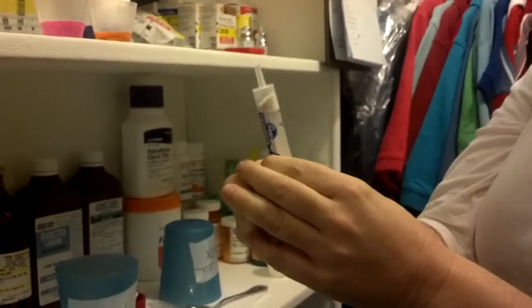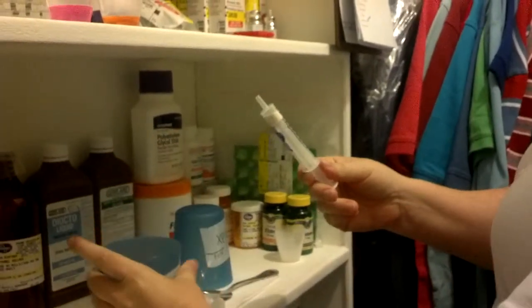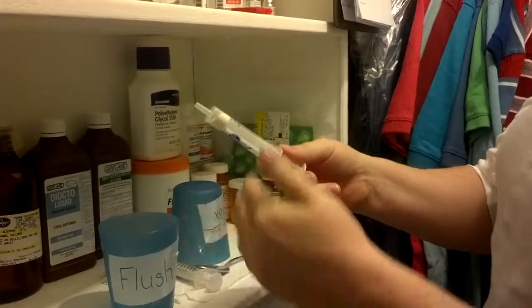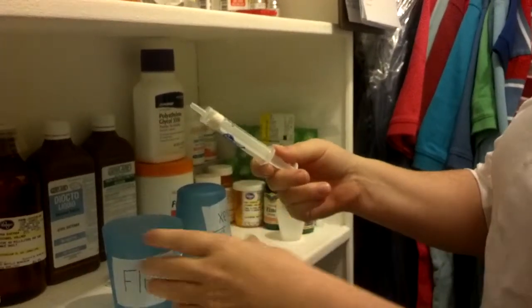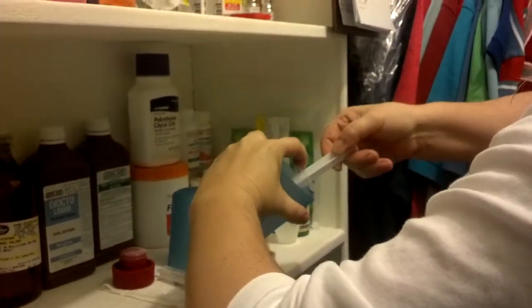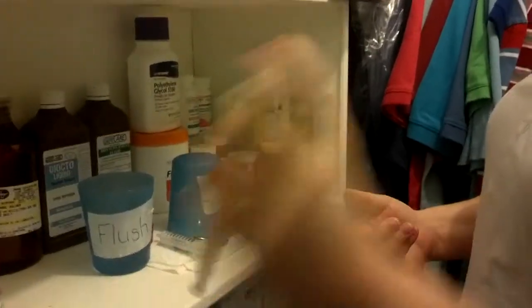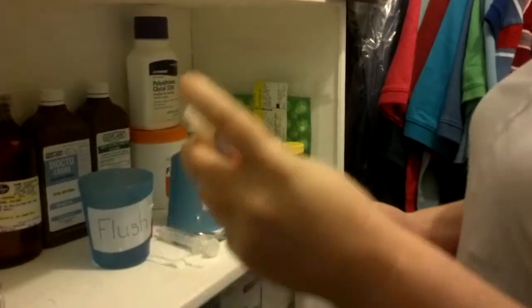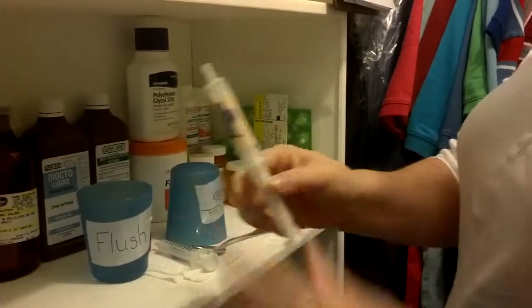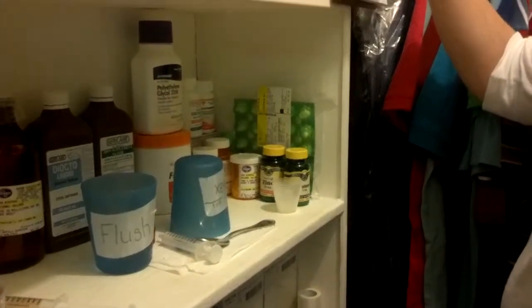Put the syringe plunger in. When I pull the flush water, I do it all at an angle — if I turn this all the way upside down, the pills go out. But if I do it at an angle and pull back at the same time while it's in the water, I'm not going to lose any of the pills. I'm at an angle and drawing up the water, then you shake to get it all dissolved. Now you have every single bit of this medication in the syringe, and the plunger is going to make sure he gets all of it.